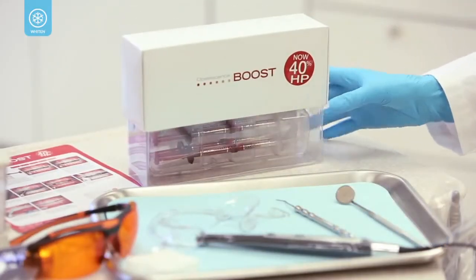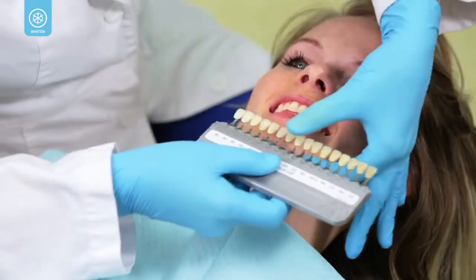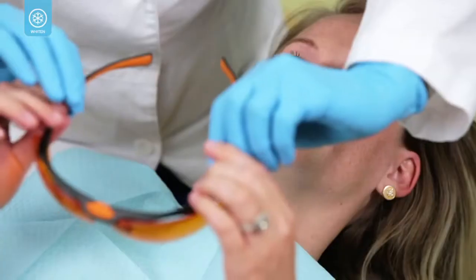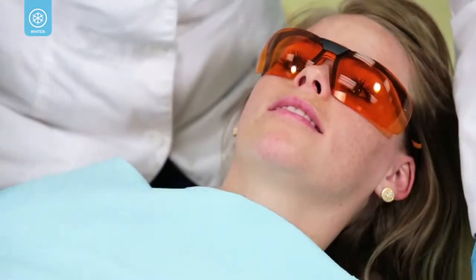Before beginning the procedure, bring Opalescence Boost to room temperature. Determine the patient's initial shade with a Vita shade guide for your records. Both the patient and the dental professional should use protective eyewear throughout the procedure.